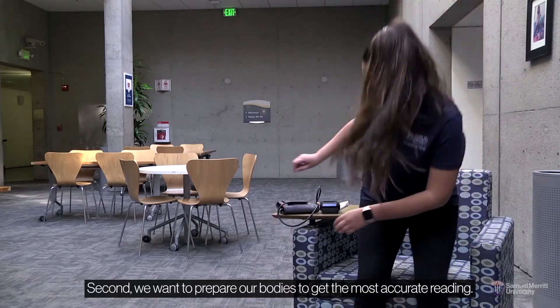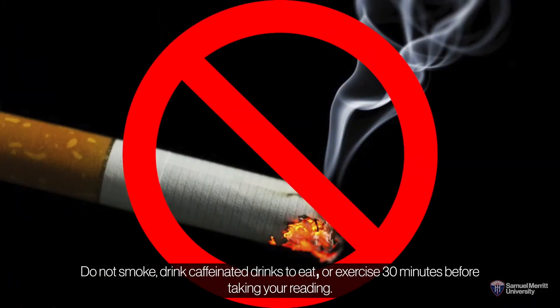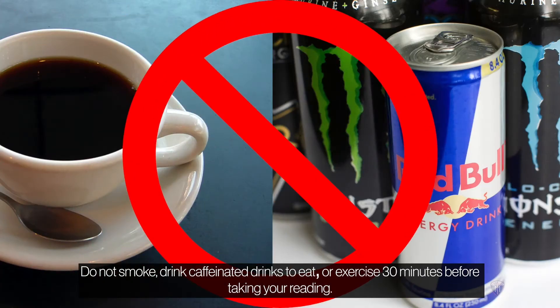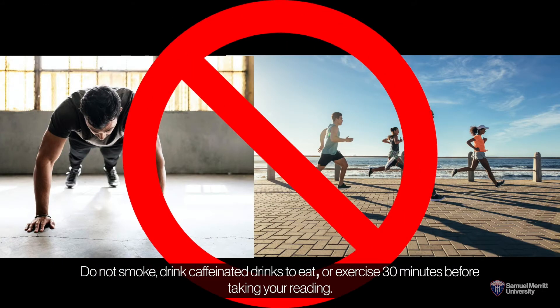Second, we want to prepare our bodies to get the most accurate reading. Do not smoke, drink caffeinated drinks, eat, or exercise 30 minutes before taking your reading.